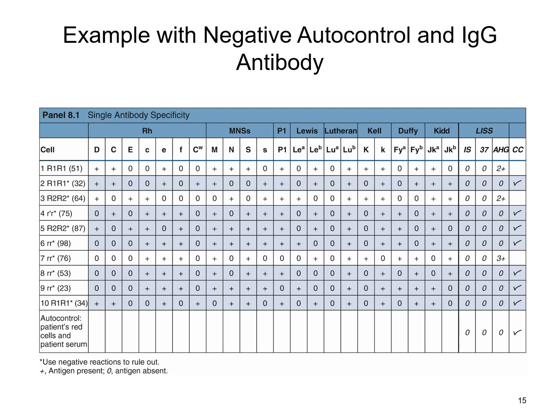So when we look at these, we're looking at the negative reactivity to do our rule-out process. So with our rule-out process, when we know that there was no reaction at any phase of the test, immediate spin, 37 degree, or AHG, we're going to look for our first negative reactivity all the way through. So that's going to be cell number 2, the one that we're going to look at first. And we're going to go across and do a rule-out process, keeping in mind our heterozygous versus homozygous, we only want to do rule-outs on homozygous cells.